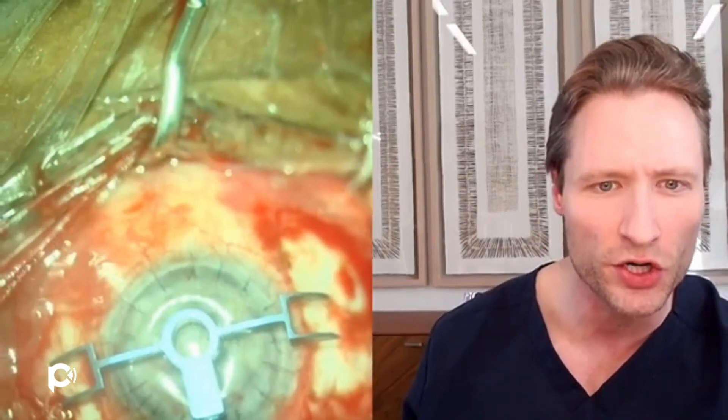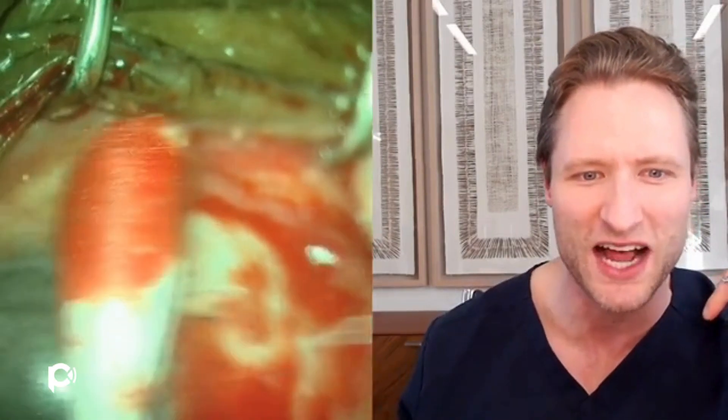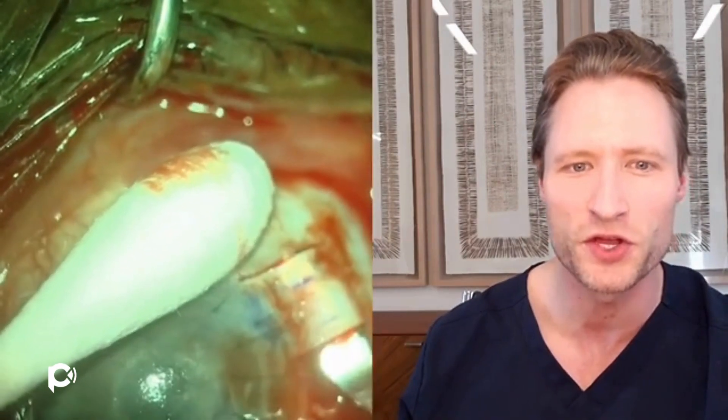The very first step is to make our scleral flaps. This is an Ashvin Agrawal marker used for glued IOLs, inked with gentian violet marking pen. It shows where these partial thickness scleral flaps will be placed, approximately centered on the cornea with the flaps 180 degrees apart. Then you make these partial thickness scleral flaps — I like to score them first with a 15-degree blade and then do my dissection with a crescent knife. I'm doing a partial thickness scleral dissection with the crescent knife, holding the eye with a cotton swab, and you have a nice flap 50% of the way through the sclera.